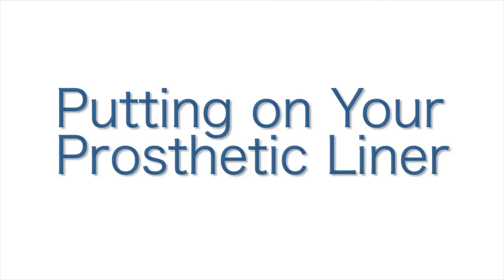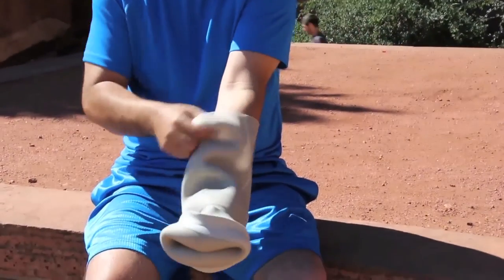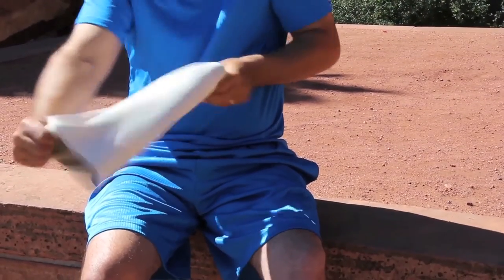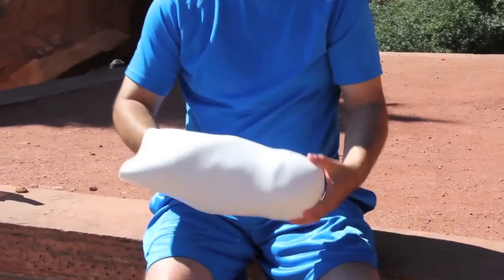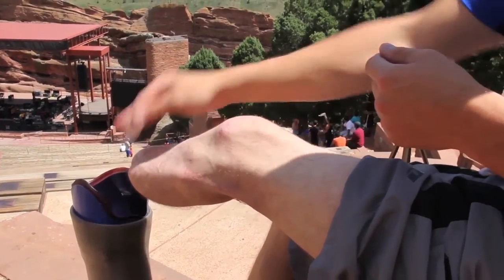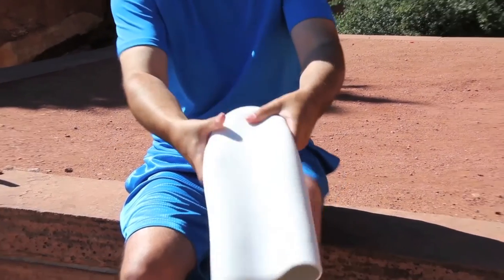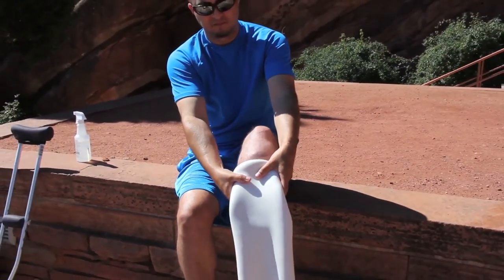Putting on your prosthetic liner. First, turn the liner inside out. Make sure the liner is clean and dry and has no substance on it that may irritate the skin. If instructed, apply vitamin D or other ointment on the skin. Make sure that a good portion of the bottom end of the liner is exposed and place it flat against the end of your limb.